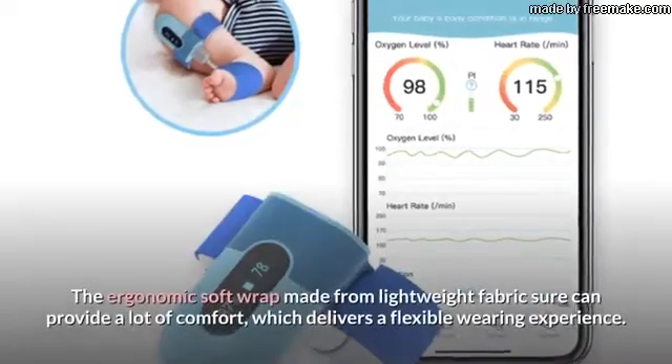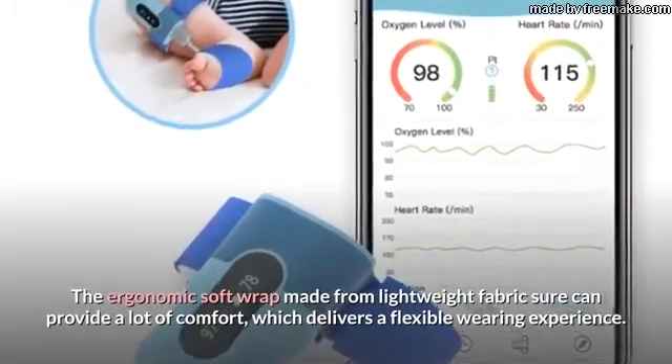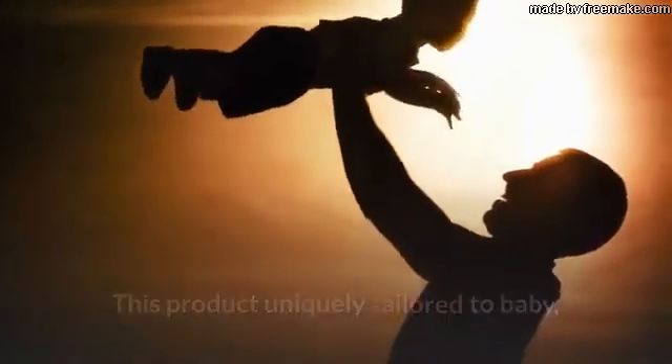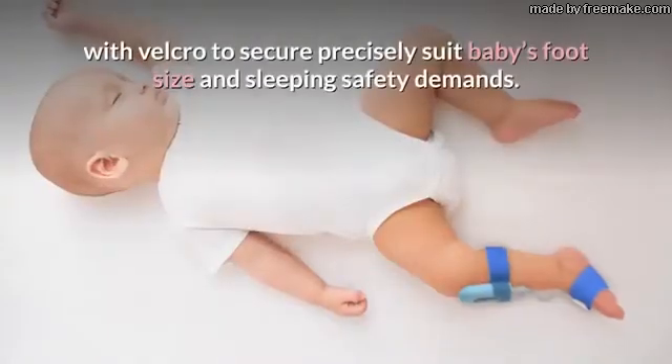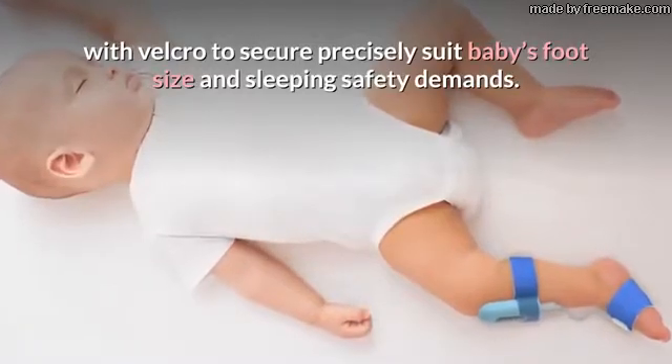The ergonomic soft wrap made from lightweight fabric can provide a lot of comfort, which delivers a flexible wearing experience. This product is uniquely tailored to baby, from newborn to toddler, with two sizes of soft wraps for different age stages, with velcro to precisely suit baby's foot size and sleeping safety demands.